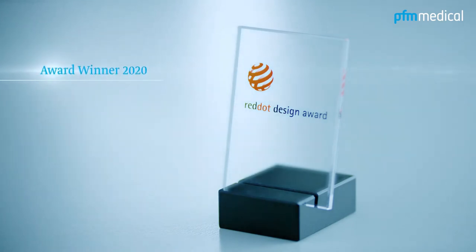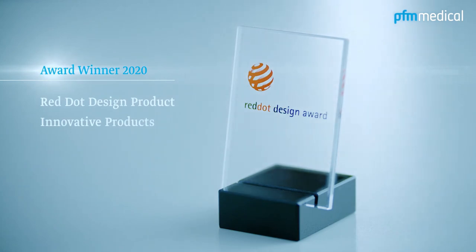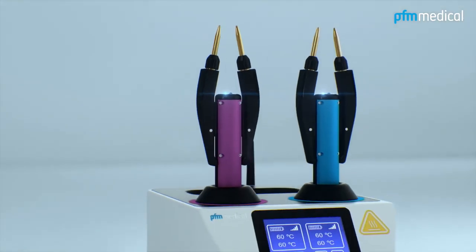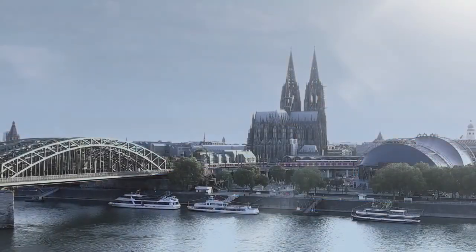Award winner 2020 in two categories: Red Dot Design Product and Innovative Products. That's why we are particularly proud of the latest member of the PFM Medical product family. And internally, we affectionately refer to it as the Cologne Forceps.